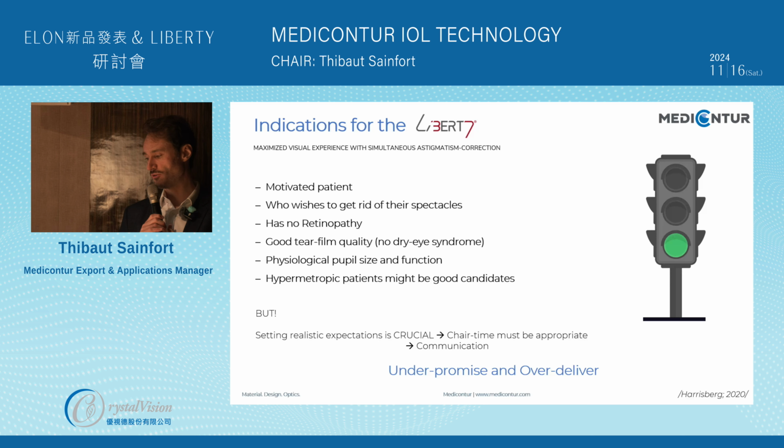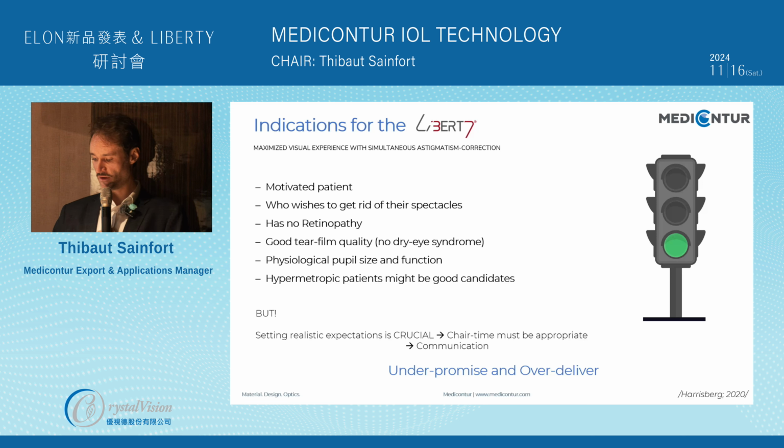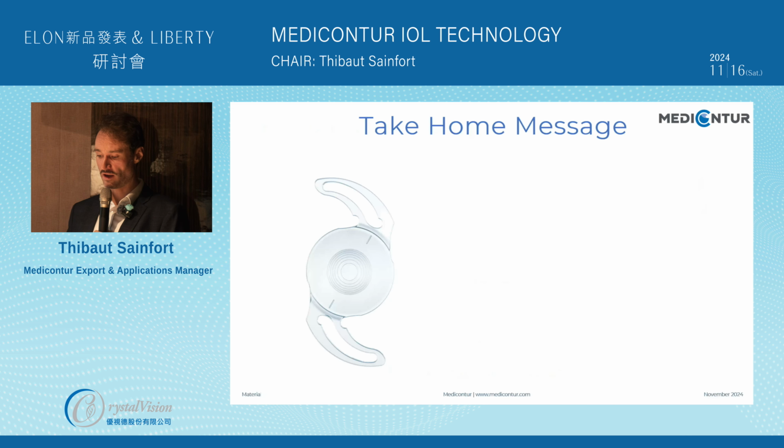So yeah, when it comes to trifocal lenses, we prefer to under-promise and over-deliver all the time. But you need to spend time to speak with your patients to know what their needs are. Because there are also the downsides of the diffractive lenses, like halos and dysphotopsia, less than with more steps diffractive IOLs, but still.